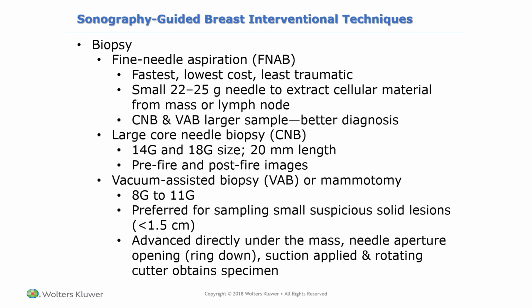So in this case, that vacuum assisted needle is going to be advanced directly under the mass. The needle aperture is then opened, and then suction is applied and rotated to kind of cut and suck the specimen into the bore.